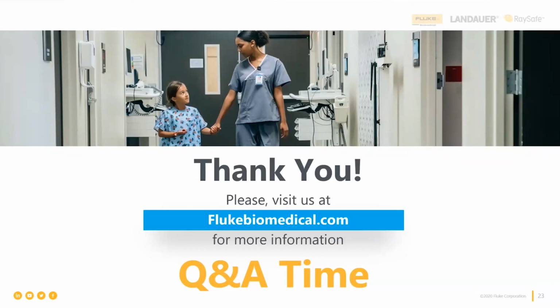Our advice on batteries that can be recharged is that every 2 years you should be replacing those batteries, just for the reasons that Justin is pointing out. And that's pretty consistently agreed to across the industry, across test instrument manufacturers, medical device manufacturers. About every 2 years, you ought to be replacing even ACLS defibrillator batteries anyway.